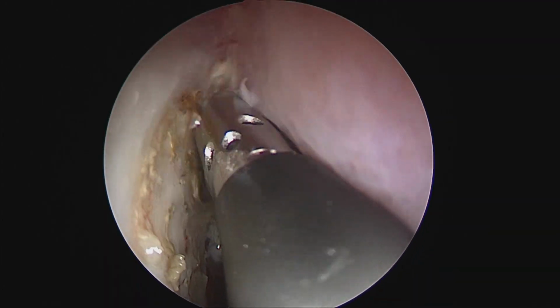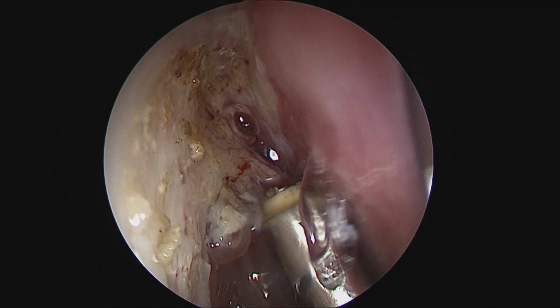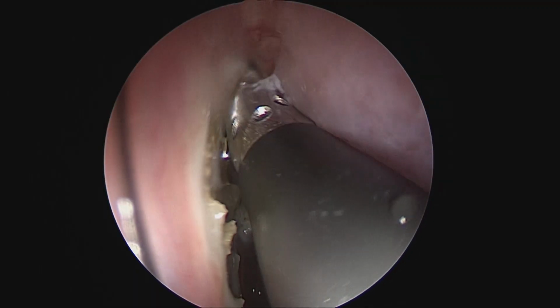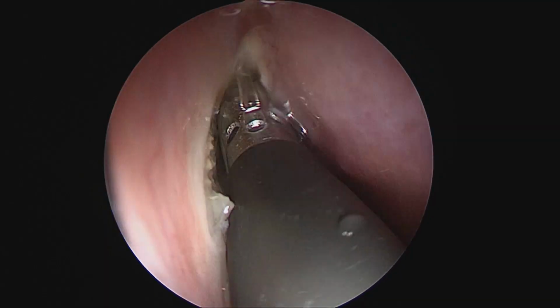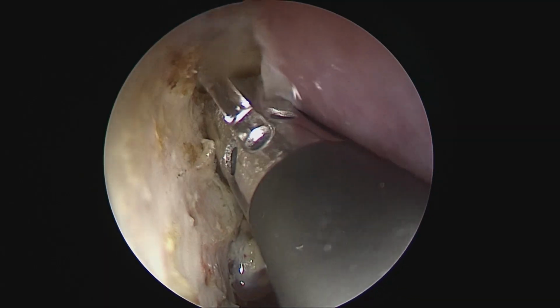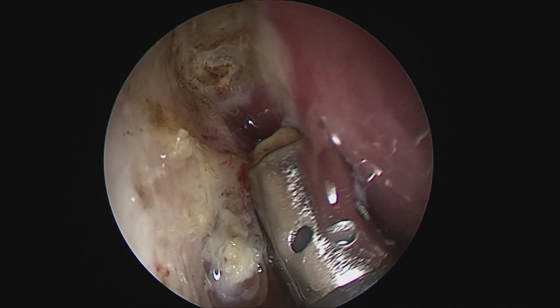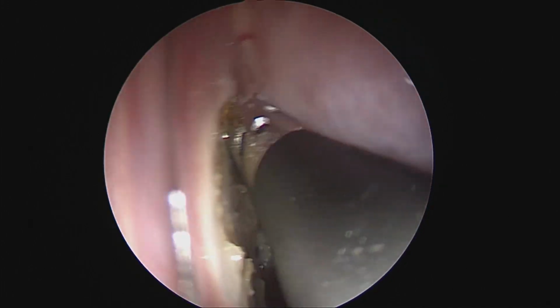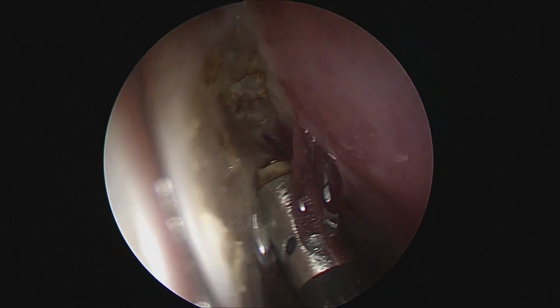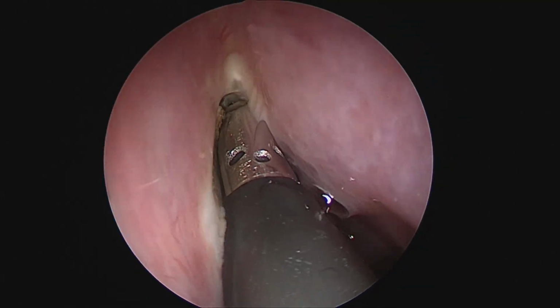Now, this is what you see. You've seen that the medial maxillectomy cavity is clearly visible, and here what we are doing is using a coblation wand to define our boundaries and to expose bone at the beak region or the frontal process of the maxilla, high up to the roof of the nose, to completely expose the bone for drilling, because we need to remove this lesion.